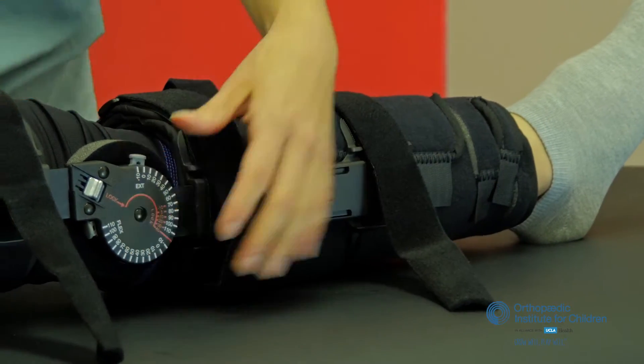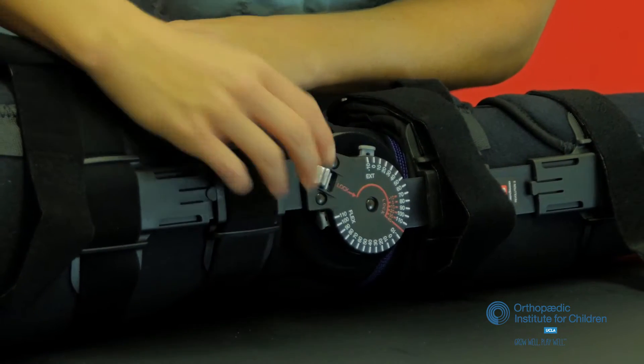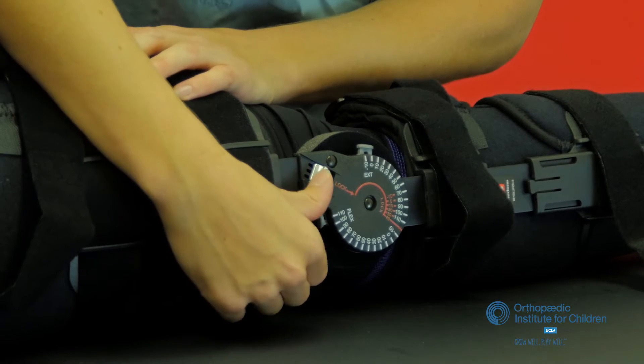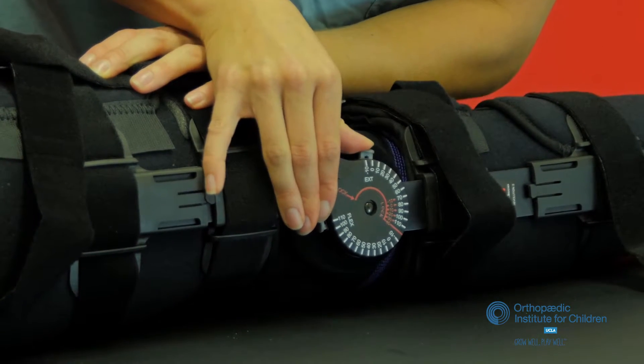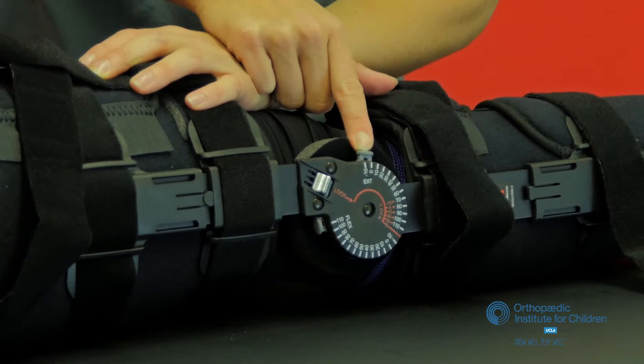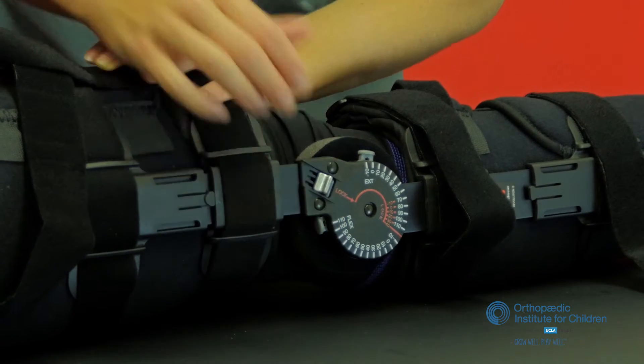On the brace you'll notice that there's a disc and there's a button that has 'lock' right next to it. Keep that button slid forward and that will be in a locked position. There's a small gray button — don't touch that. We'll adjust that in the office if need be. Keep that metal tab slid forward in a locked position.